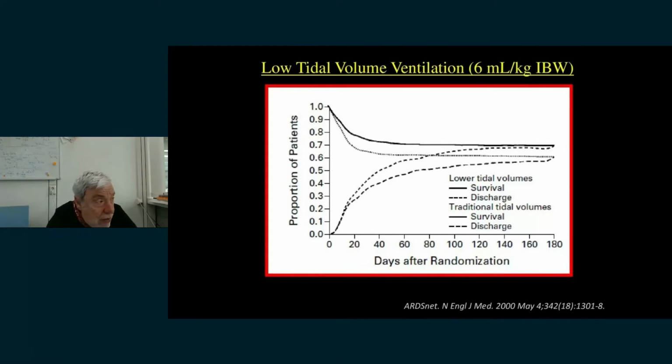And this, of course, is one of the few studies, one of the 3 studies, in which we were able, in 40 years, to show something positive in mechanical ventilation. We have the low tidal volume, 6 milliliters per kilo, which is practically a normal tidal volume. In a normal man, we do not breathe more than 6-7 milliliters per kilo.